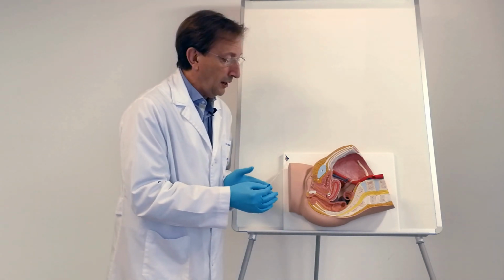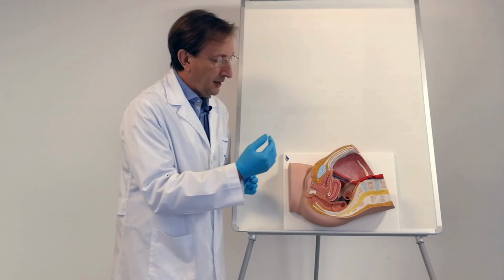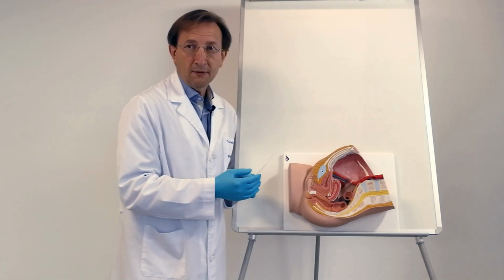This is the easiest way to access this cavity to obtain the endometrial fluid in such a way that we don't generate any problem neither for the patient nor for her subsequent pregnancy outcome.